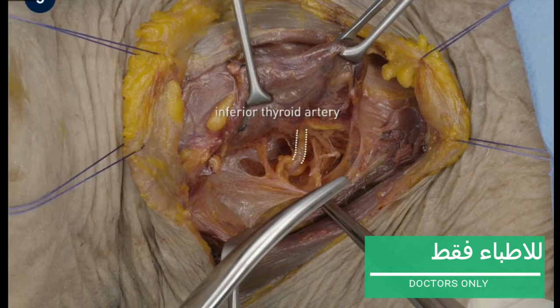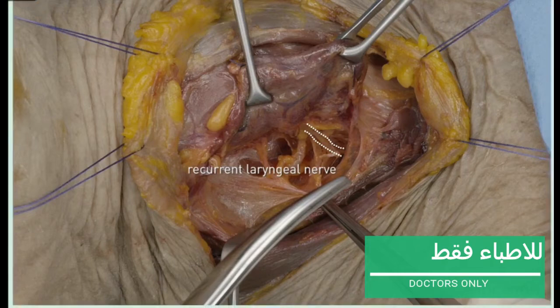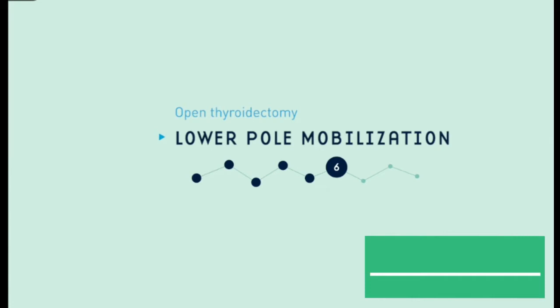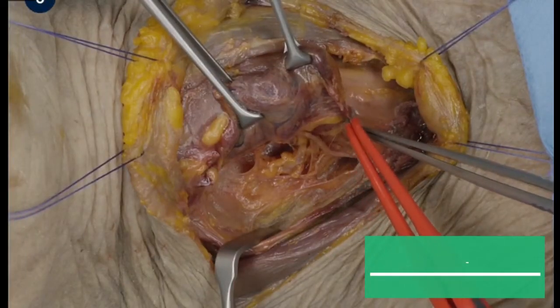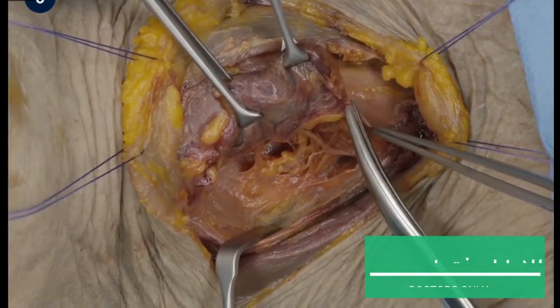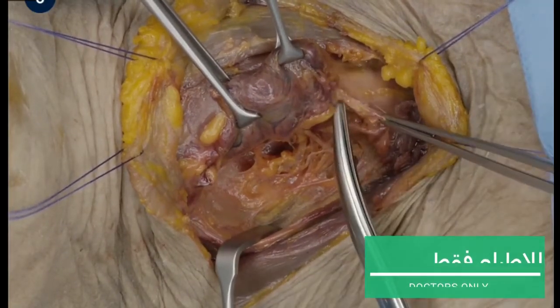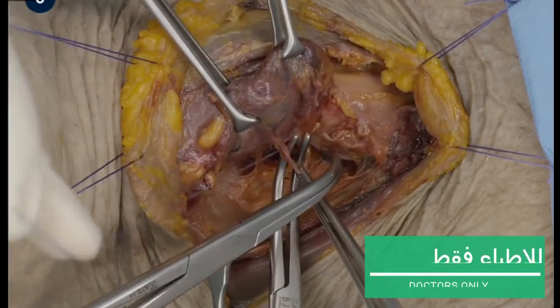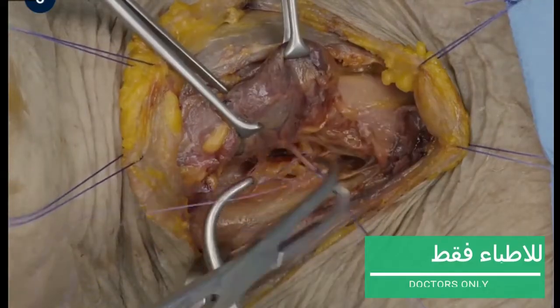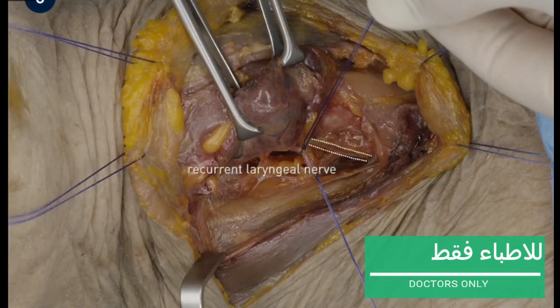The inferior thyroid artery and recurrent laryngeal nerve are visualized. To mobilize the lower pole, the thyroid ima is ligated, followed by the ligation of the inferior thyroid artery. Again, the inferior thyroid artery and the recurrent laryngeal nerve are shown.